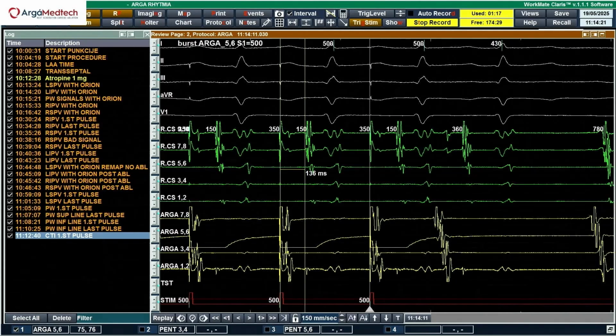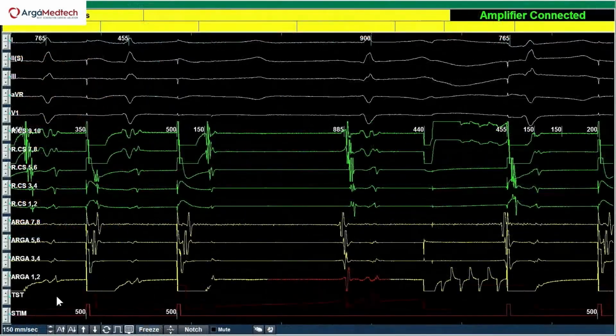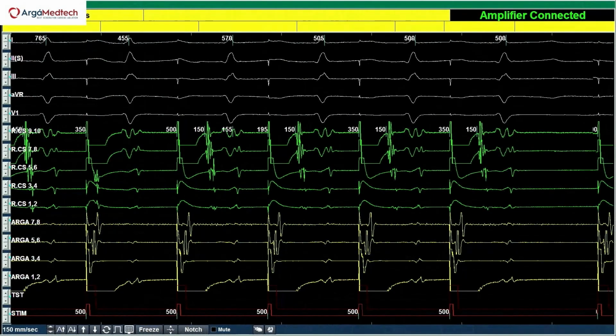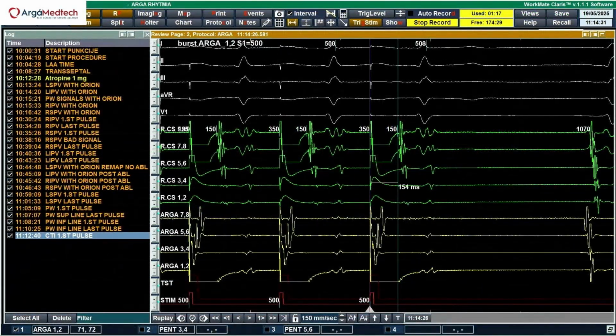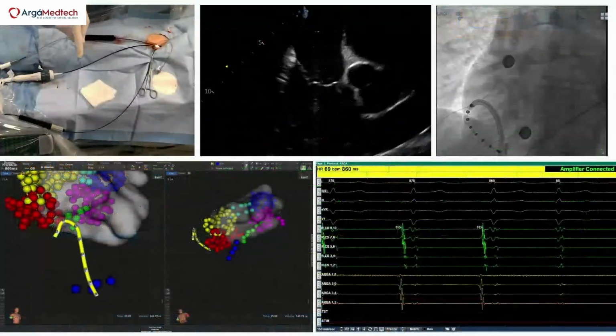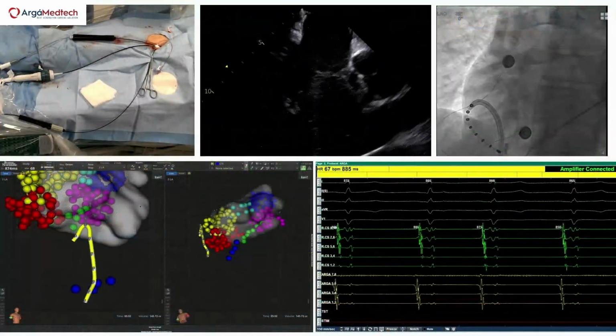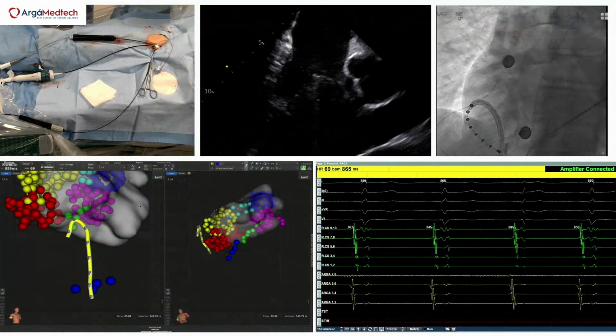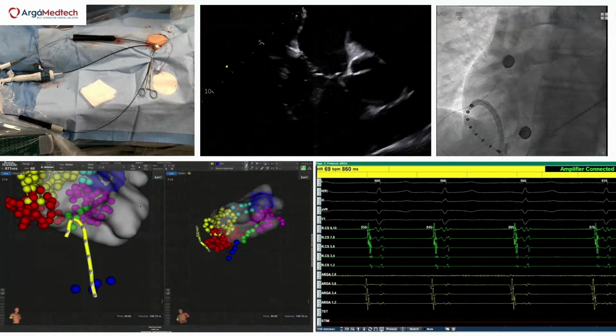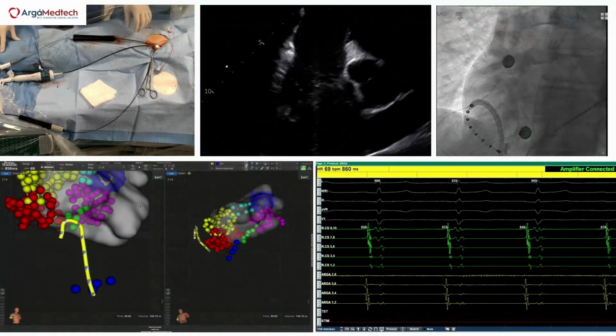Can you now pace RA 1-2? Measure. Now you see it's 150-something because I closed the line. So we can have block. I would pause here and I'm ready to field questions because we're going to do more in the CTI. We're going to do more focal lesions, something like that. But we are done with the case showing. Ready to receive questions.